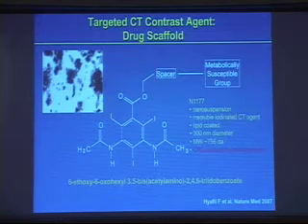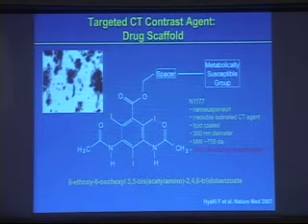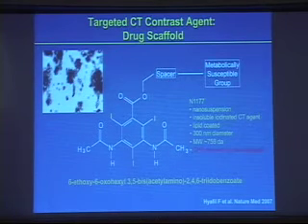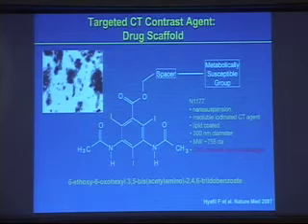Let me talk to you about 2 examples here, one based on CT, because we agree with the previous speaker, CT is really the only technique today that we could do very nice coronary imaging with. CT, as you have shown, has a nice spatial resolution, only if you could do better with CT. So can you take CT from anatomy to molecular? That's a challenge we have.